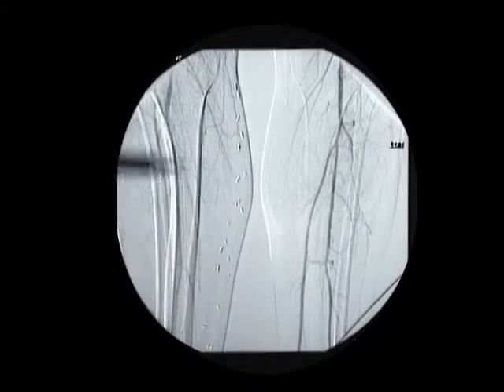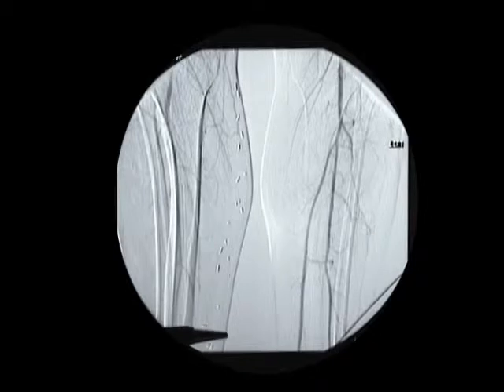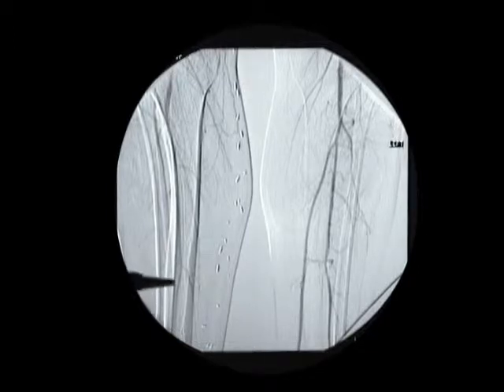However, the right leg shows no reconstitution of named vessels. The vessel that was seen in the initial image is actually just a small branch and not a named vessel. With no named tibial vessels in the runoff and especially with prior vein harvest, this right leg is in fact appropriate from an anatomic standpoint for inclusion in the trial.